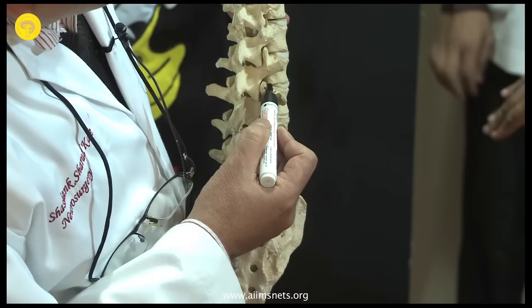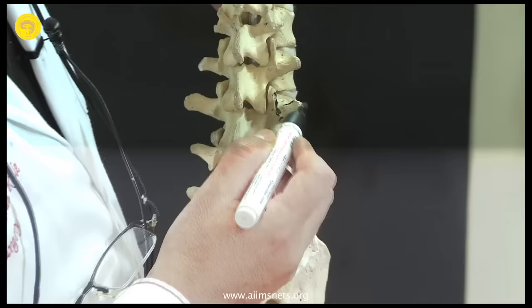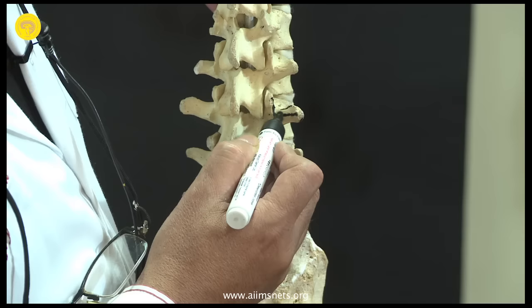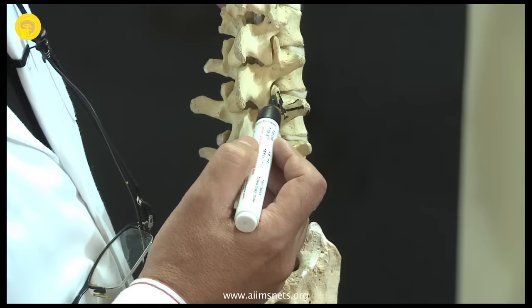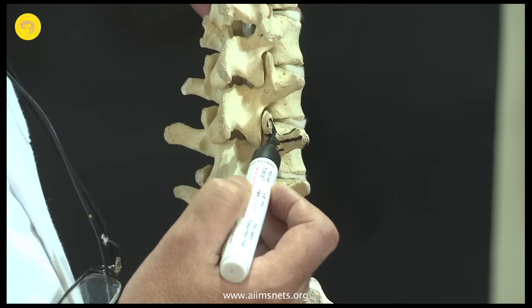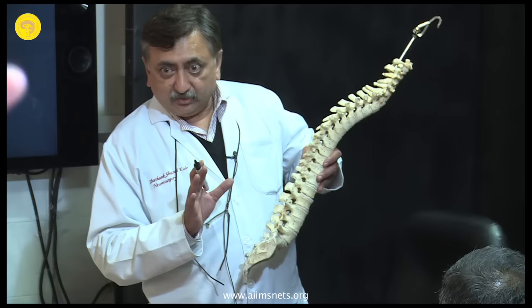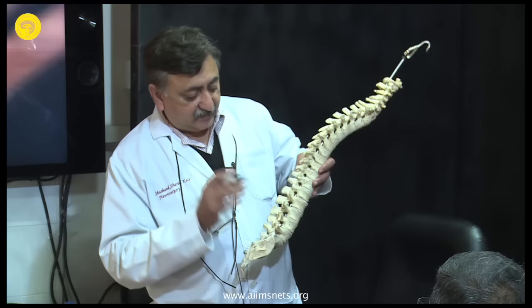You see that? The second line you draw is, you identify the whole transverse process like this, and a line drawn right in the middle of the transverse process. Do you see that? So a vertical line which is just outside the facet, and a horizontal line which is in the middle of the transverse process. Now the point at which these two lines intersect is your entry point for the lumbar pedicle. So whenever you want to do a pedicle screw fixation, for the beginning, it is in your interest to identify the whole transverse process, at least the superior margin and the inferior margin.